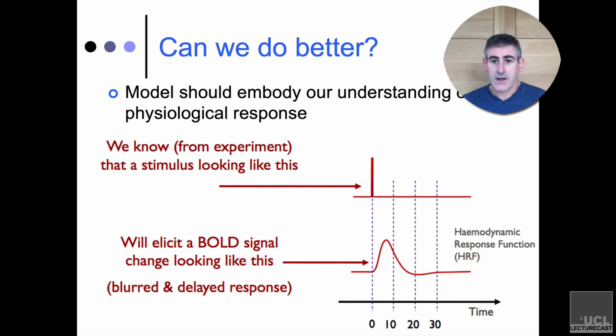So that is our estimate of the relationship between the neural response, which is effectively instantaneous. It's on the order of milliseconds anyway, and the blood flow response, which is anything but instantaneous. It's slow, it's a little bit sluggish, and it's smoothed out over time. So it happens on the order of 5 to 6 seconds later at its peak response.